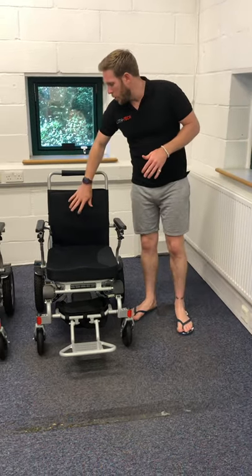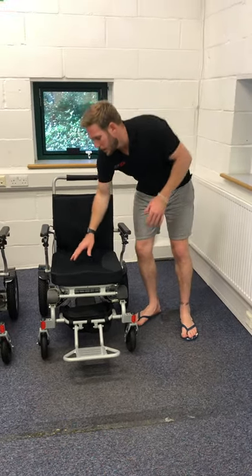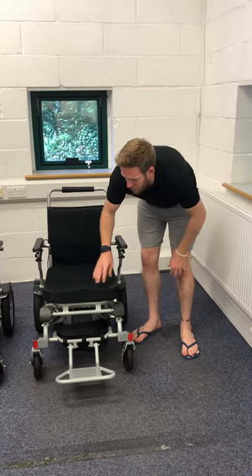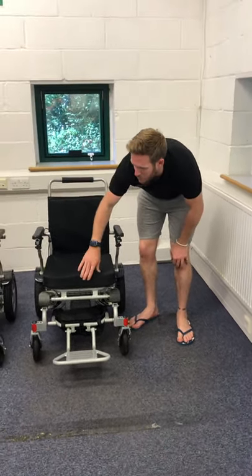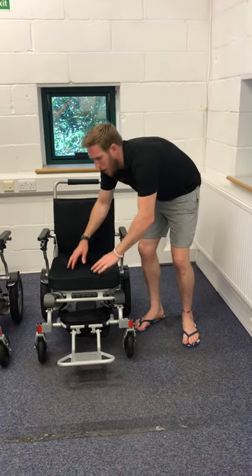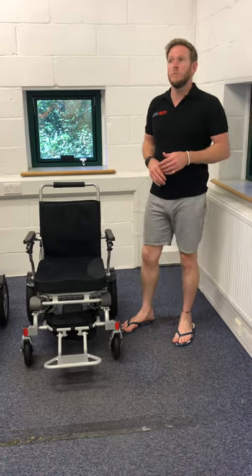It's now got new extra-soft cushioning in the back and a nice spongy ergonomic cushion. The old cushions were about two and a half inches and now they're closer to three, with nice contoured lines which make for a much more supported and more comfortable ride.